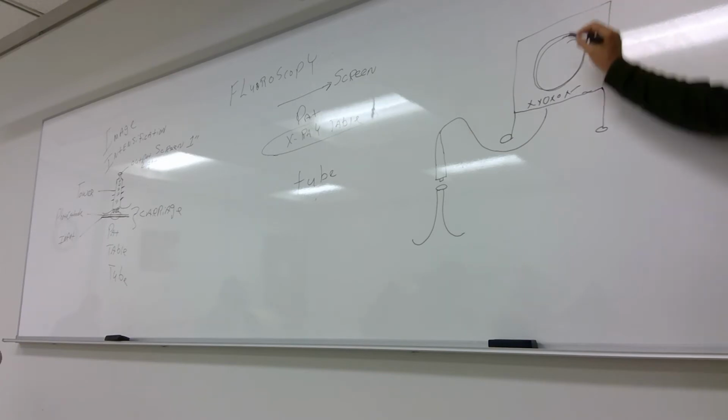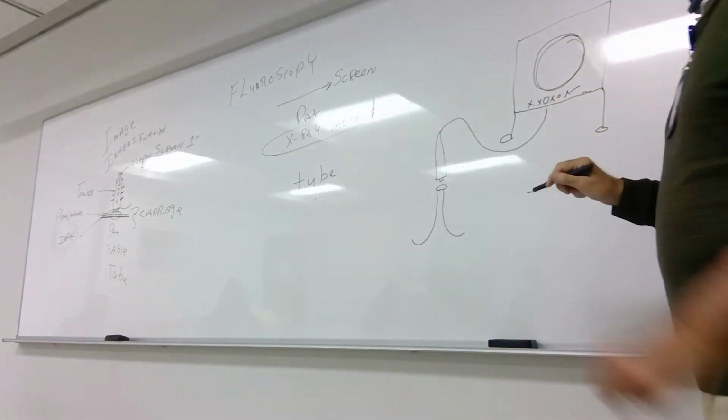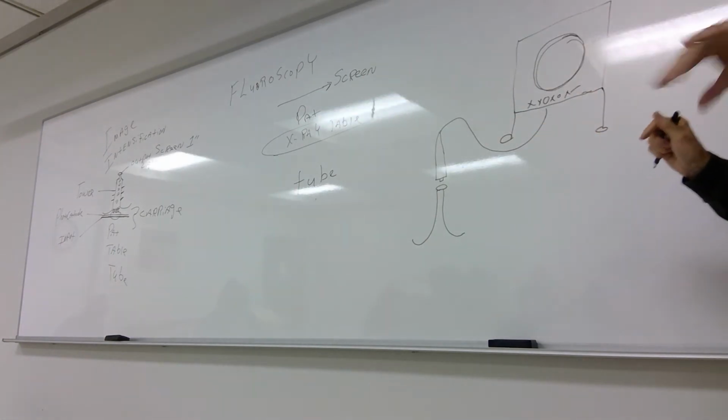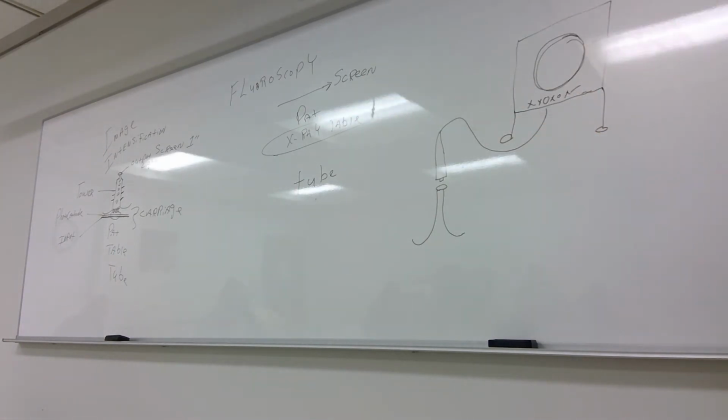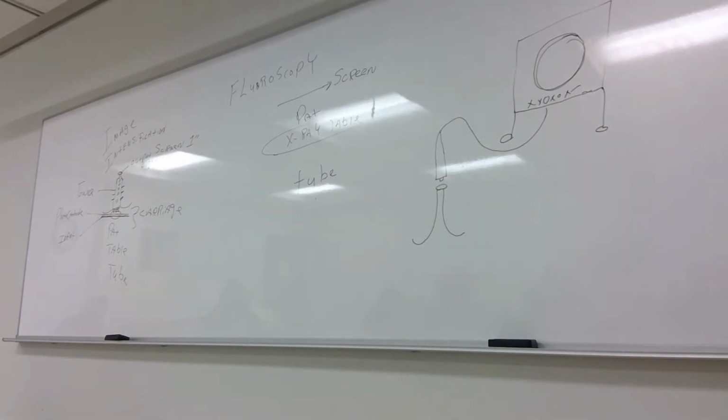So what is this? These are controls. What would this be? Viewing screen. All right, so what is this now? It's a TV monitor. Now go backwards to this. What is this? Tower. Oh, no, the tower is in the II, the image intensifier. What's this?